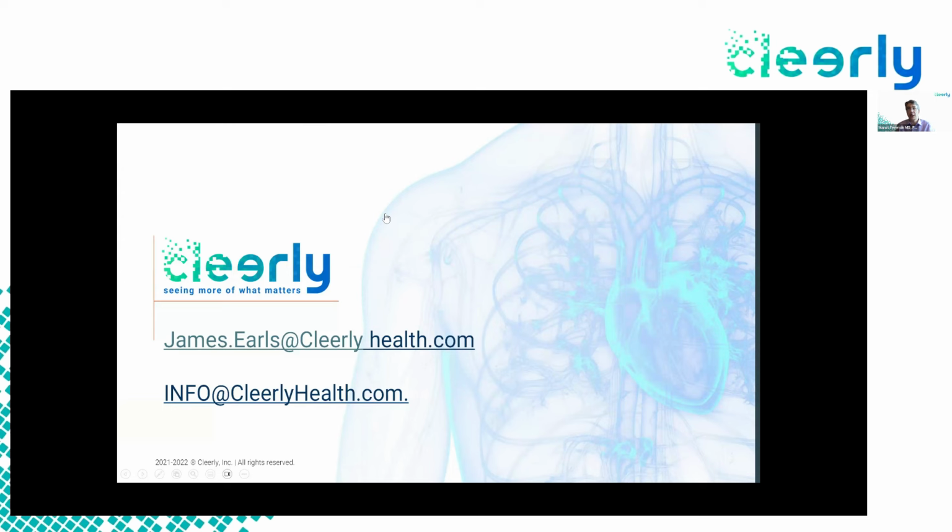For AI-QCT ischemia, it's an AI-ML-based prediction algorithm that is based on the analysis of the plaque, stenosis, and vessel morphology. And again, as we showed on the slides, it's fed into the AI machine learning algorithm and the prediction whether the ischemia is present or not is based on the derivation, and then the validation data set is performed. For FFRCT, it's a computational fluid dynamics simulation where you segment the arteries and you get a lumen, you perform fluid dynamics assessment and calculate basically the pressure in the vessel and at every point in the vessel.